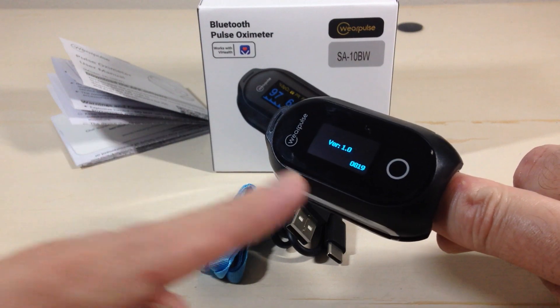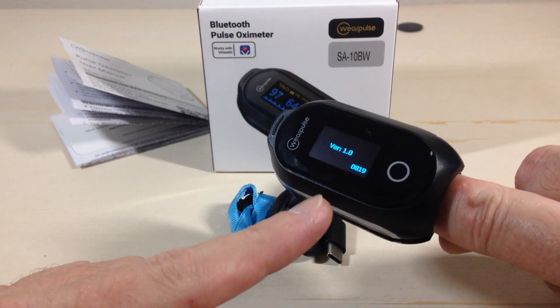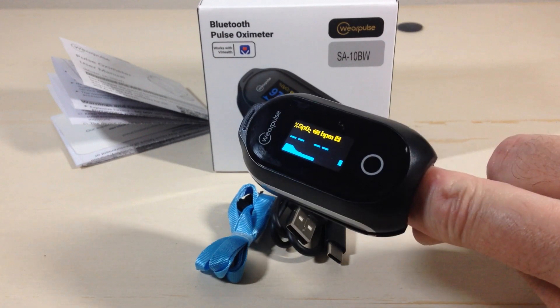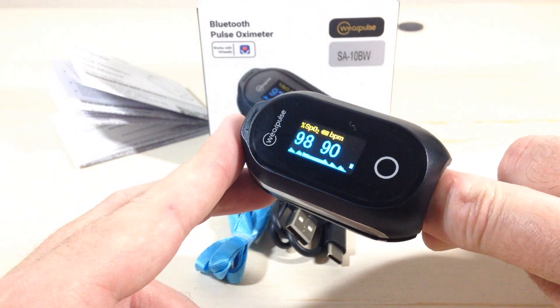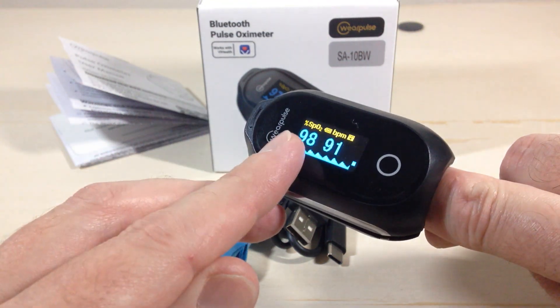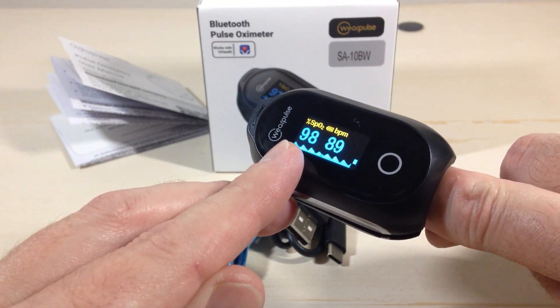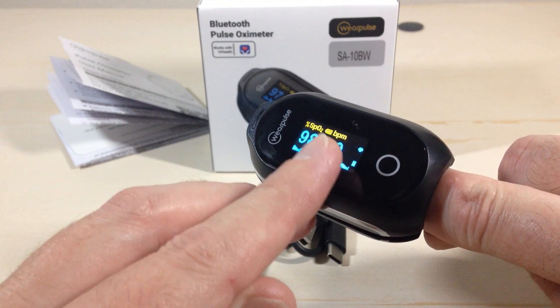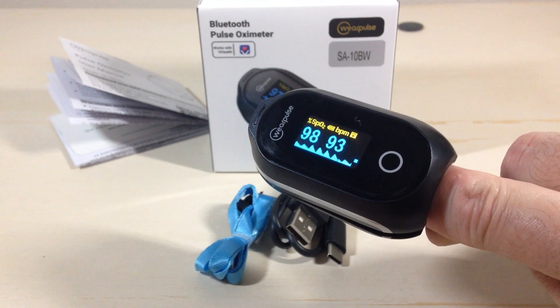It turns on automatically, shows you the time, and shows you the software version. Then it will start taking a reading. It's a nice multi-color OLED display. On the left-hand side you've got your blood oxygen level, on the right-hand side you have your heartbeats per minute, and in the middle you have your battery level.